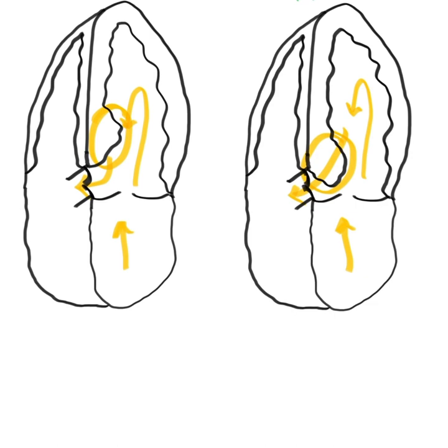And not every time will this be quite obvious. As we all know, the endocardium can be pretty difficult to see sometimes on some patients. And so if there's thickening or a piece of the wall that is thicker than others, and you aren't cutting it just right, maybe you can't see it. So another way to identify this is what we call the dagger-shaped waveform.